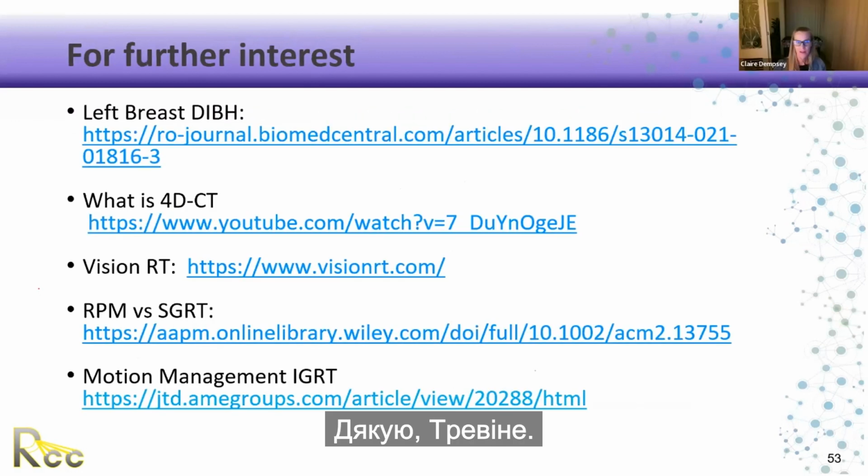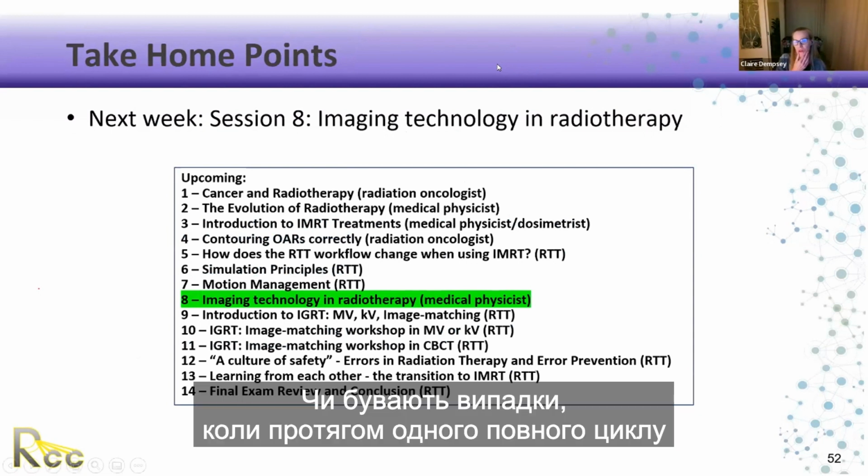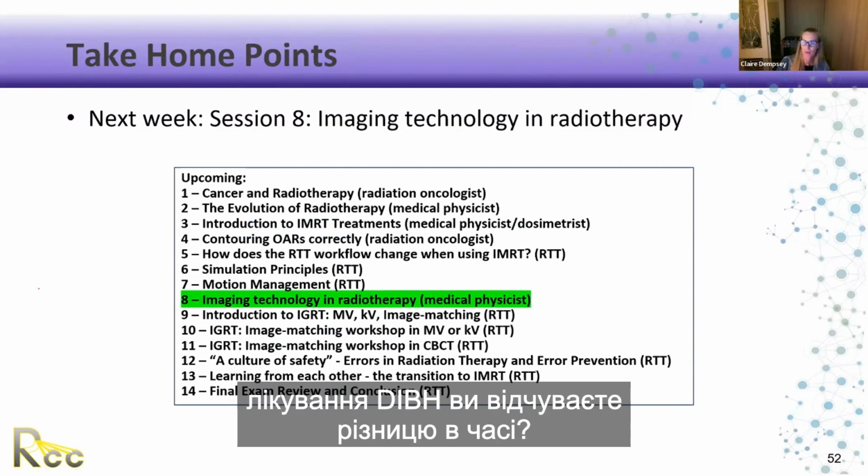Excellent. Thank you, Trevin. Couple of questions just from the chat. So are there times when you experience differing timing in one complete cycle during the DIBH treatment?